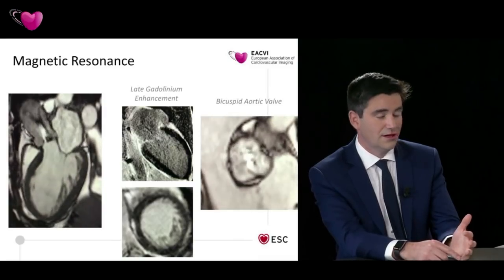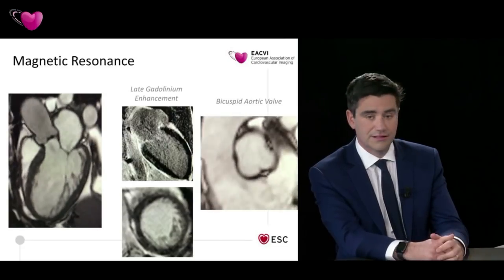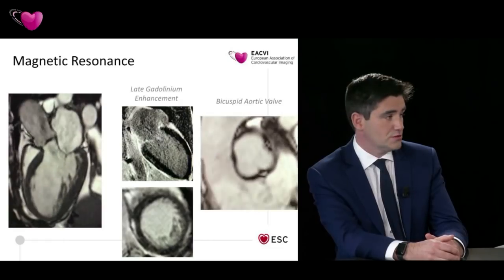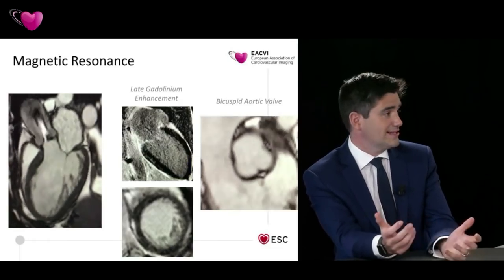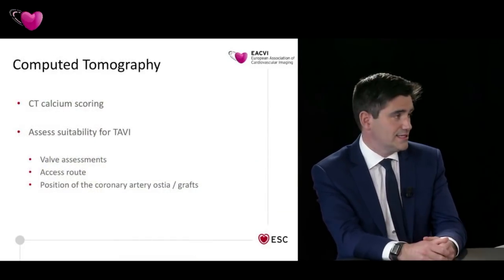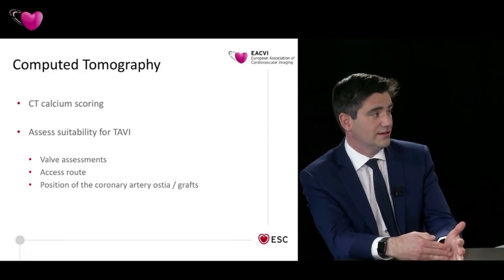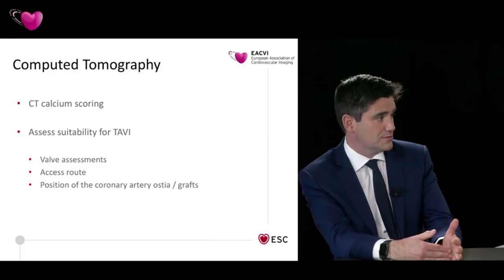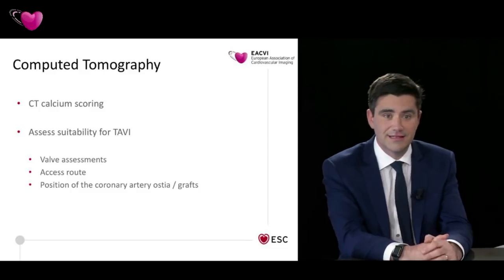She's frail. She weighs 40 kilograms. She has a history of smoking and a diagnosis of COPD. And so in the workup of patients towards TAVI at our institution, we generally turn towards CT. And so that's the next test that we did. When we were planning the CT scan, we wanted to know, as you said, is it truly severe aortic stenosis? And so we did a non-contrast CT calcium score to help us work that out. And we'll talk about that in a bit more detail in a second.